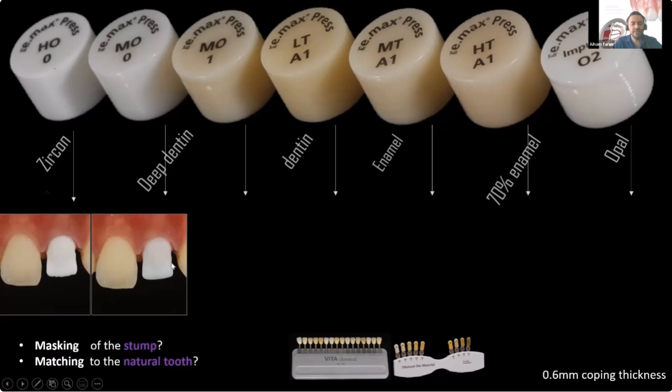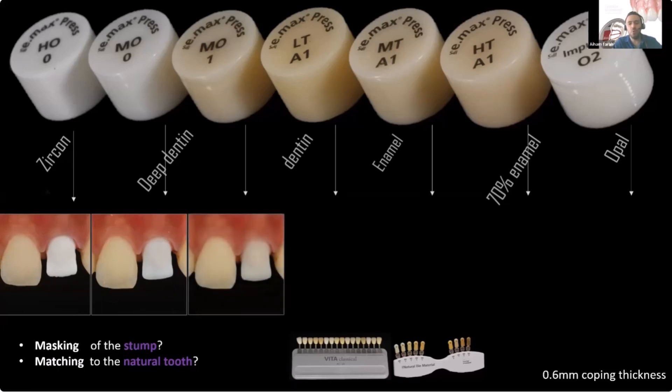When you see MO zero, it's still masking well — a little bit less than the high opacity ingot — but do I really need more masking than that? No. It's masking almost 90%, and I can see just a little bit of the stump shadow. But it's still far from the A2 central in shade, so I'd need to stain it, bake the coping after staining, then start layering the final shape on top. It's a bit more difficult.